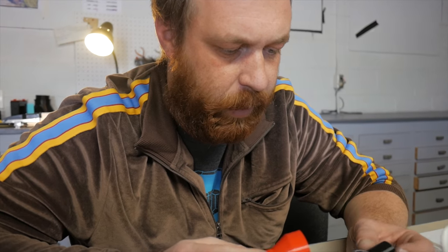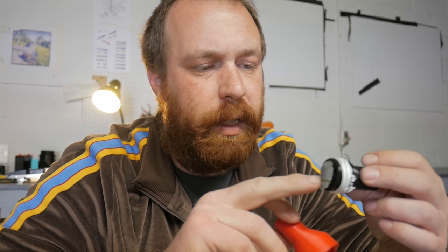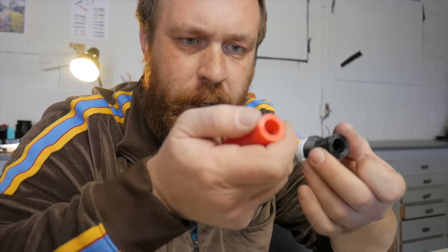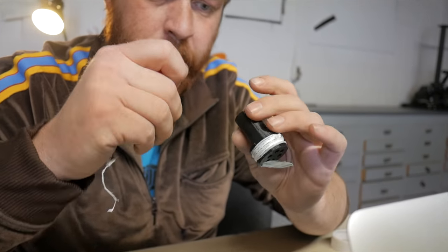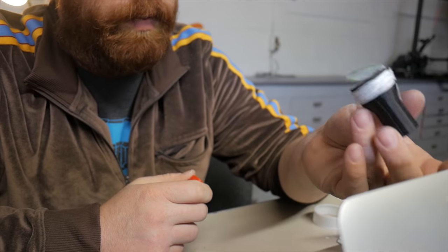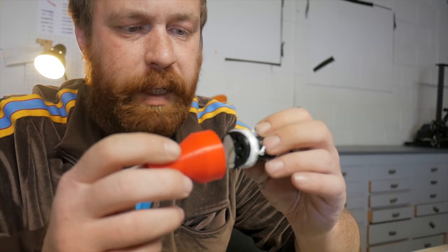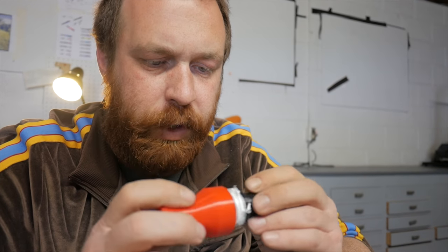Right now it takes about an hour and a half to print this whole thing, and we'll make a little jig to cut out the diaphragm, so you can do that in a few seconds. I printed these at the same thicknesses that I would normally print camera parts, so that they're durable and you can beat on them, but at this point they're maybe a little too durable. I hope to shave 20 to 50% off the print time by making them thinner walled where unnecessary, eliminating some of the space for the diaphragm to move, and pushing the thread tolerances.